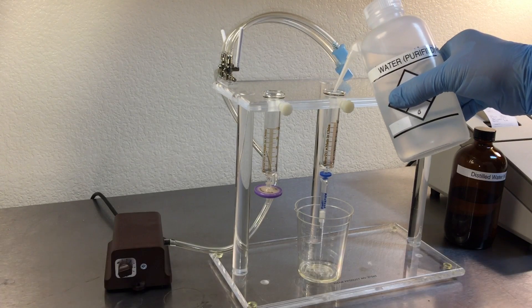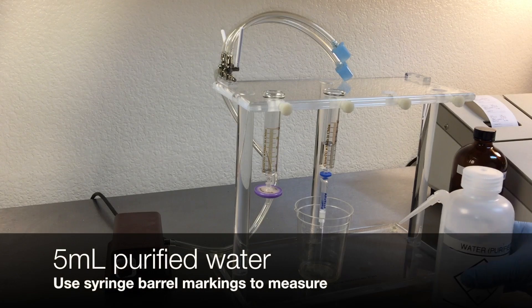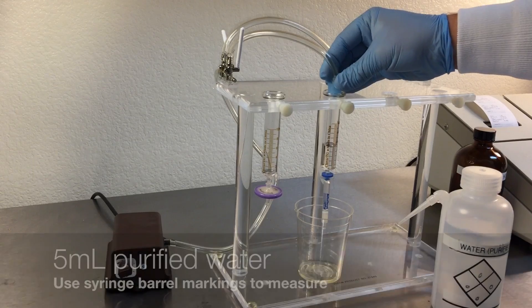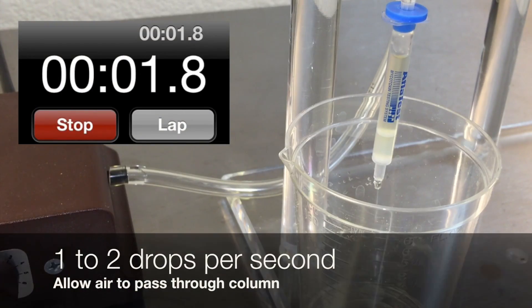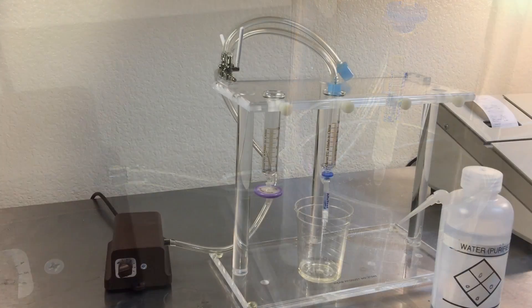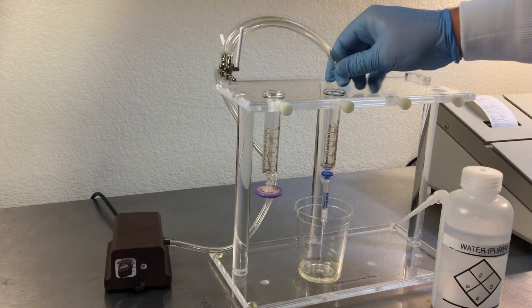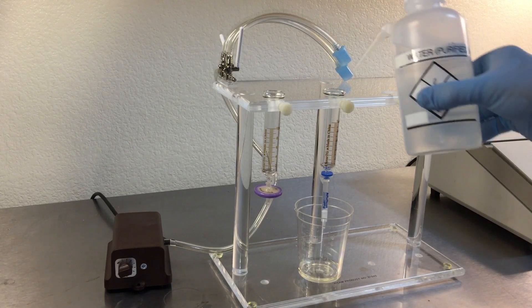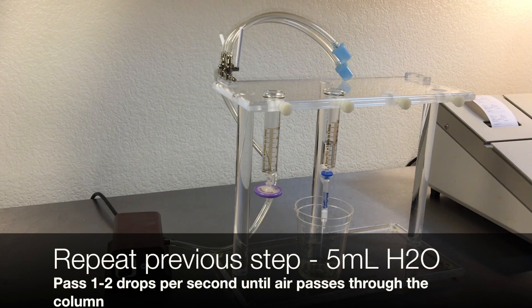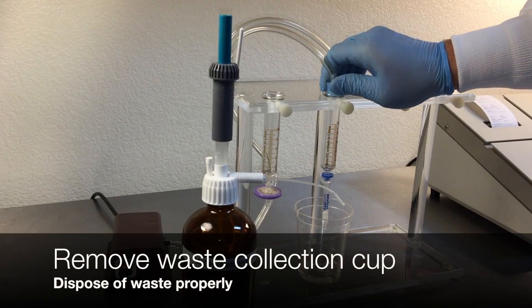Once air has passed through the column, remove the pressure. Add 5 milliliters of purified water, apply pressure, and pass one to two drops per second through the column. Repeat: once air has passed through the column, remove pressure, then add an additional 5 milliliters of purified water, apply pressure, and pass one to two drops per second through the column. These steps use the water to wash away any impurities left by the sample.